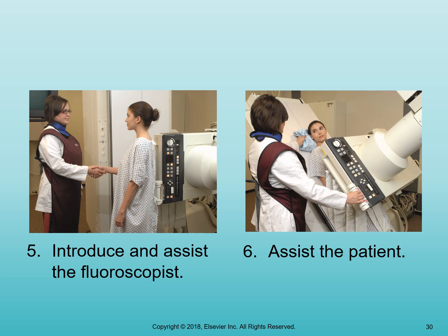This is where you ask the patient if they followed their prep. If they tell you yes, I would ask them, what was that? And they'll usually say, oh my gosh, I haven't had anything to eat since last night. I'm starving. And then you would take a scout image to prove that the patient had nothing in their stomach. There was nothing obvious showing up, not excessive air in there. And then you would be able to proceed with the procedure at that point.